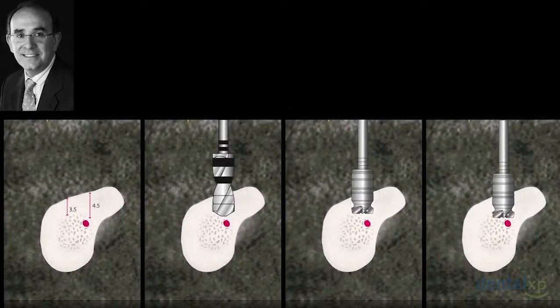In the mandible, we are using exactly the same approach. We drill carefully. I always recommend gaining experience first in the upper maxilla, but the advantage if you place a wide diameter implant is that you really open a good window. You can see with the loupe of the microscope, and you can even observe the nerve, and of course, it's better to maintain 0.5 millimeters of security distance.